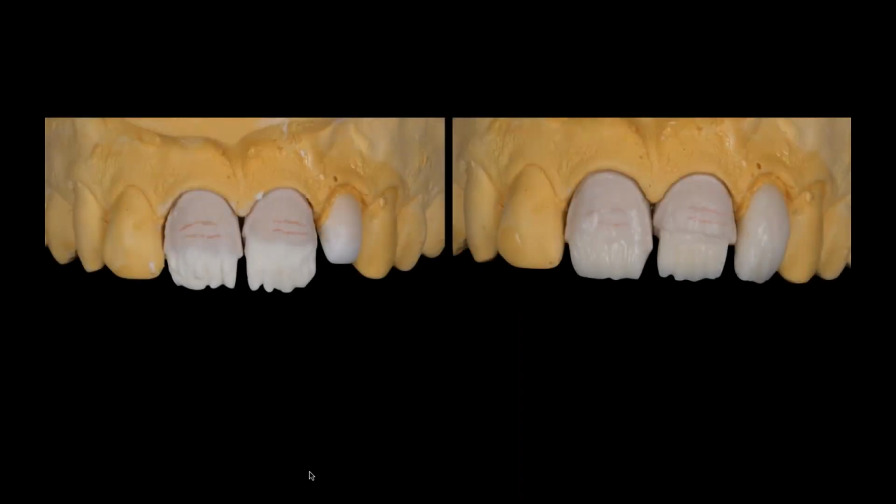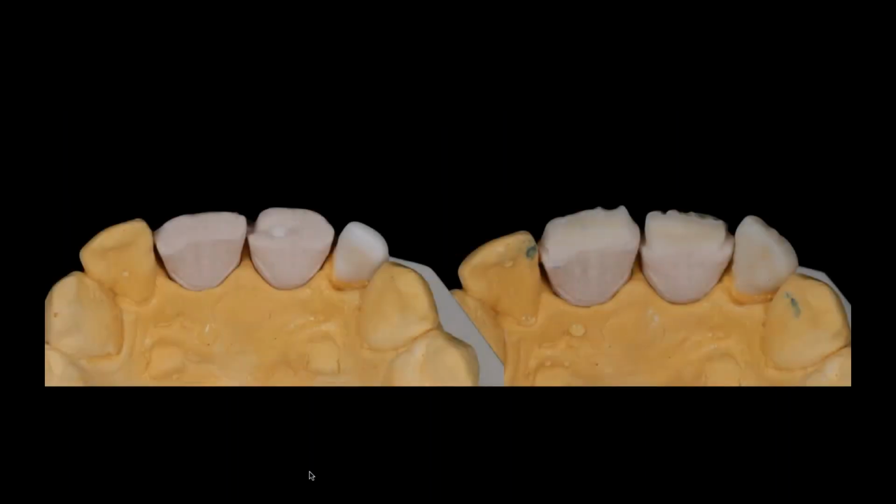And in this particular case, it's an older case, it was actually a VM9 case. I used EC1, which was our effect chromo one, which is very white. But I'm going to be honest and tell you, EC1 on its own, the very white opacified material, wasn't enough, because I'm going to make it very thin, and you'll see a view of this, I think, from the incisal edge that I shoot. Yeah, so if you look down from the incisal edge, you can actually see it's almost nothing. It comes to a point. Well, even my most opacified material won't be opacified the thinner it gets.